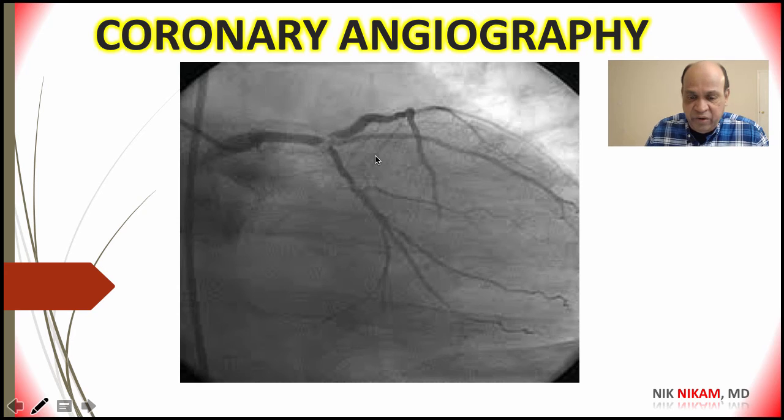One way to do this would be to take this patient for coronary artery bypass surgery and perform complete revascularization. If this patient had this type of angiogram, along with critical stenosis of the right coronary artery, then definitely the treatment of choice would be coronary bypass surgery. And it is especially so in high-risk patients, such as those who have hypertension, diabetes, and reduced left ventricular function.